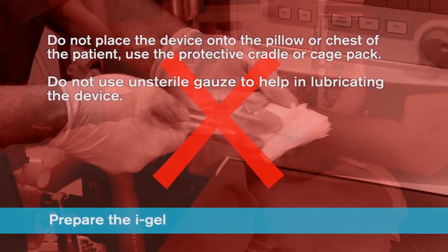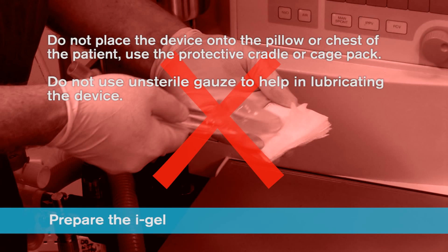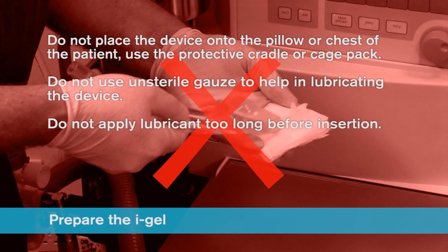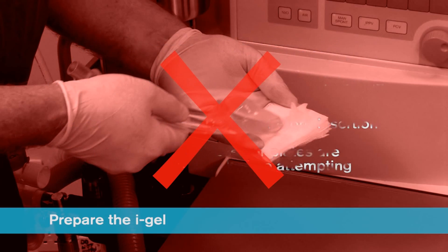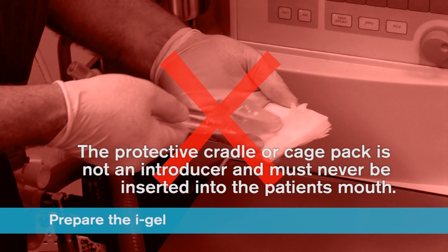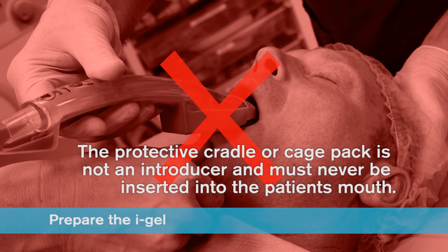Do not use unsterile gauze to help in lubricating the device. Do not apply lubricant too long before insertion. Always ensure dentures or plates are removed from the mouth before attempting insertion. The iGel must always be separated from the protective cradle or cage pack prior to use — these are not introducers and must never be inserted into the patient's mouth.